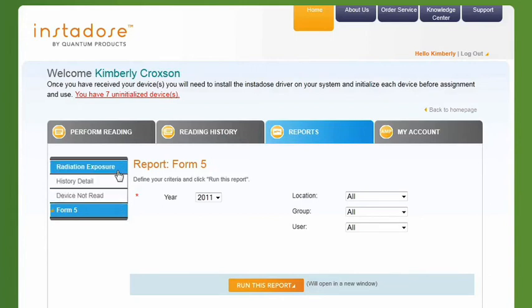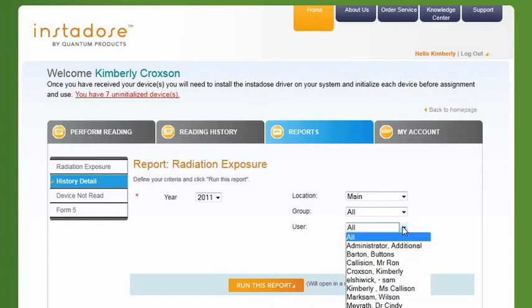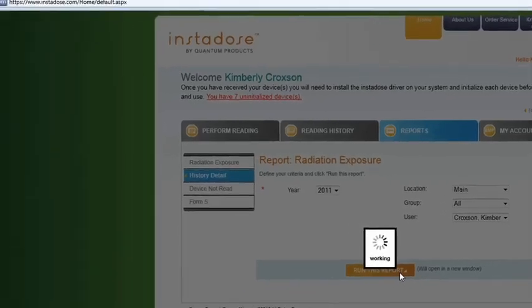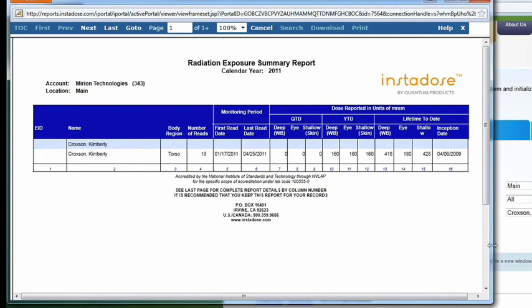Let's run a Radiation Exposure Report, since it's the most common type of report. Click on Radiation Exposure, define your criteria, and click Run this report. The report will open in a new window and can then be printed or saved as a PDF.